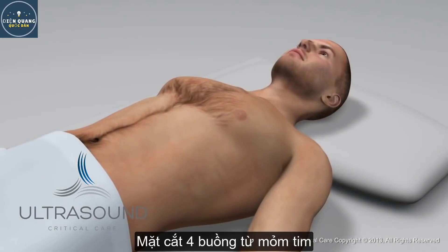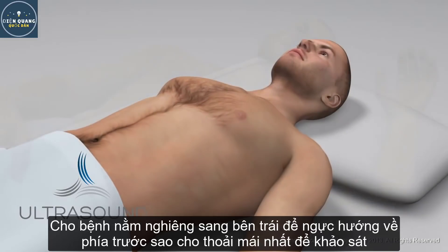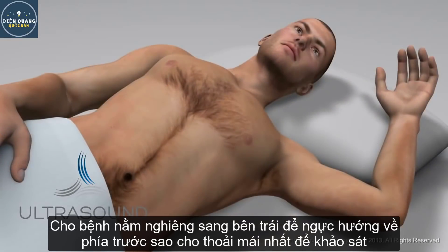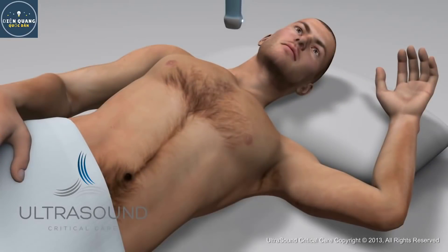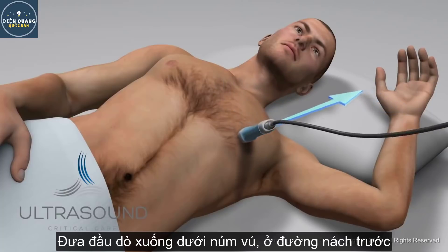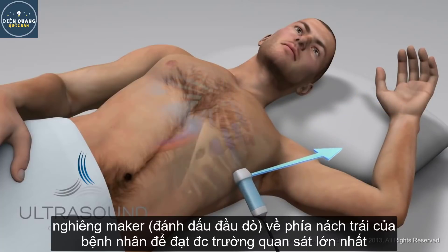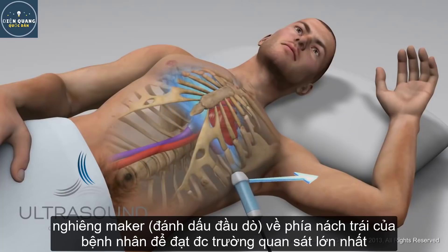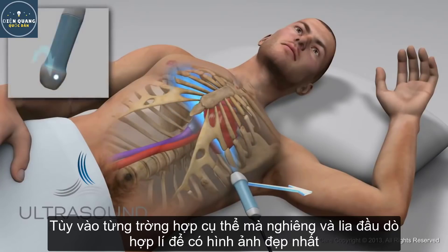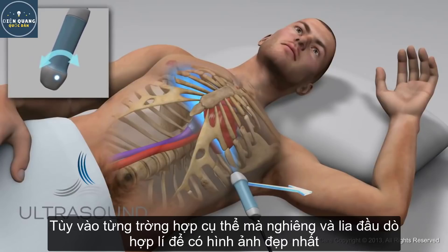Apical 4 Chamber View. Turn the patient onto their left side, as this will pull the heart forward in the chest for better visualization. Scan down the nipple line with the dot aiming towards the patient's axilla. Tilt the probe upwards towards the patient's point of maximal intensity to obtain the view. You may need to tilt up and down with the probe to obtain the best image.